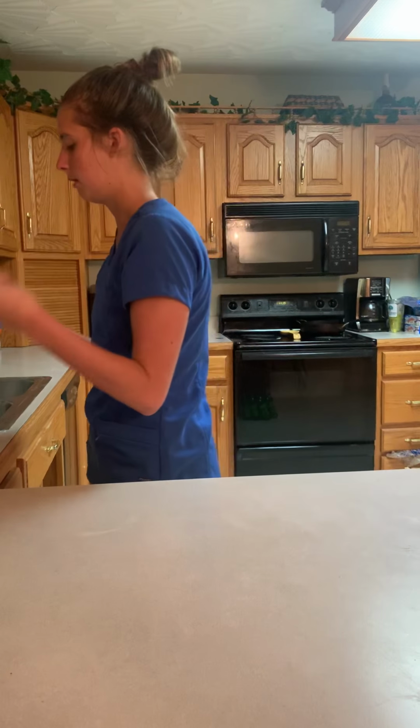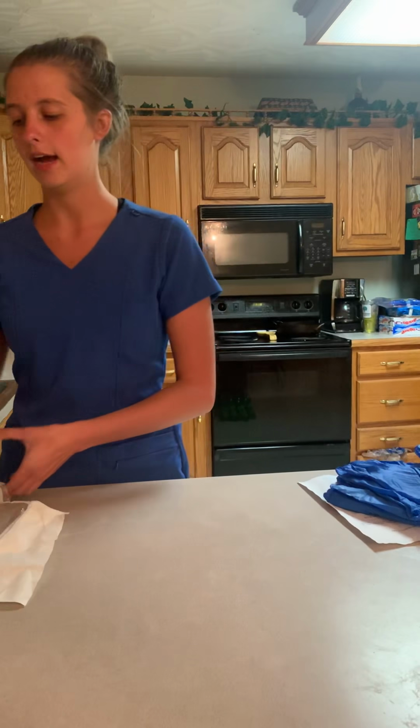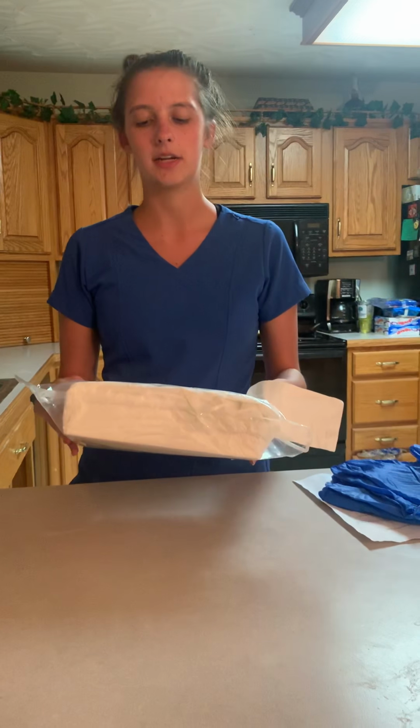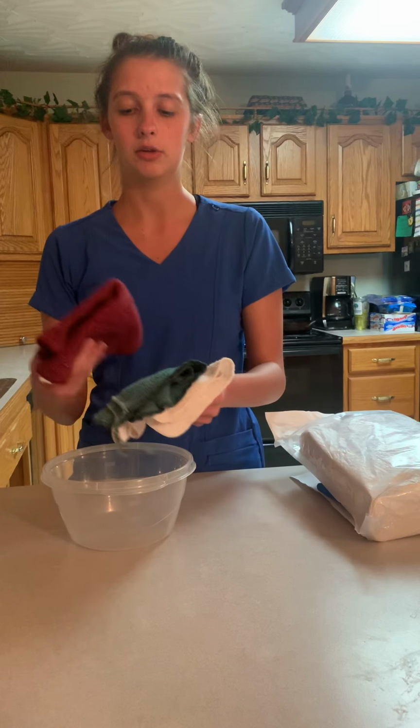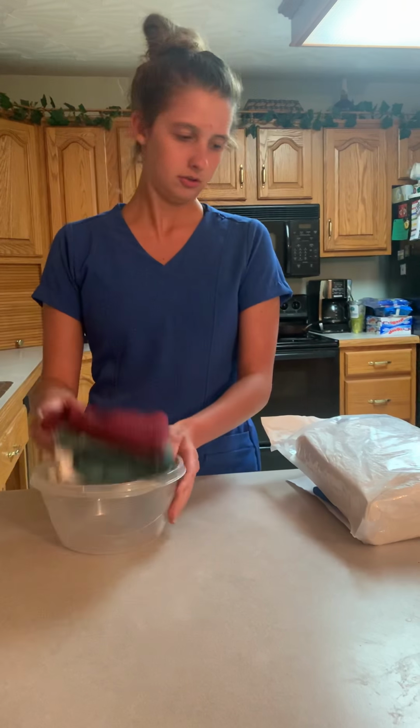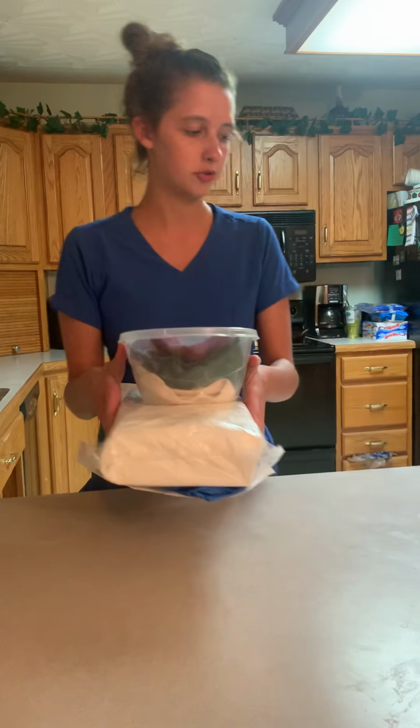Then I'm going to gather up all my supplies. So I have my healthcare provider order. I have my non-latex sterile gloves that are sterile, unopened, intact, and unexpired. I have my clean gloves. I have my sterile catheterization kit, and it is unopened, intact, and unexpired, and it is sterile. And I have my 3 clean washcloths, and I have my basin filled with warm water and soap. So I'm just gonna get all that together, and we're gonna go into the patient's room.